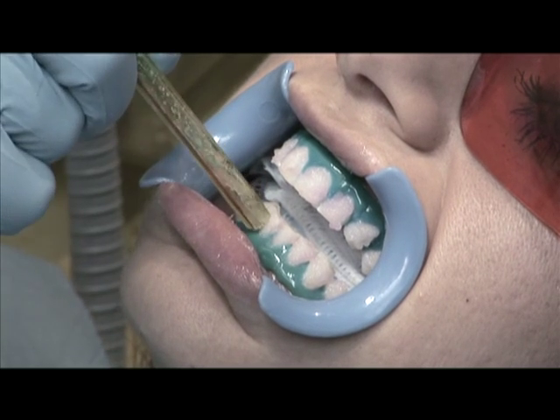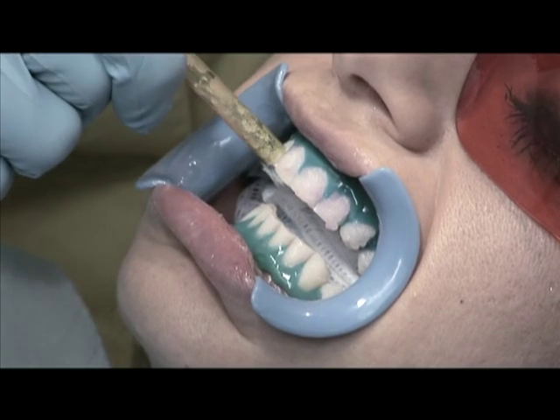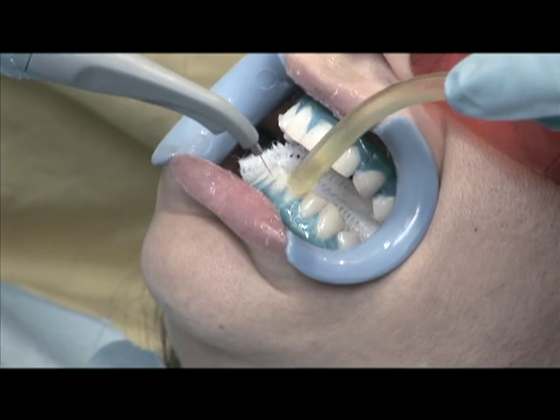After completing both arches, the whitening cycle is completed by removing the gel that has now become inactive. Use a surgical aspirator to remove the gel and then rinse the surface.